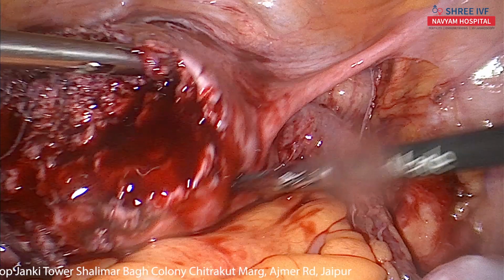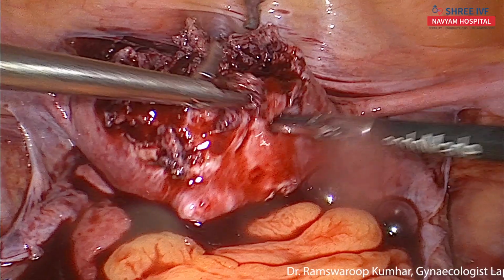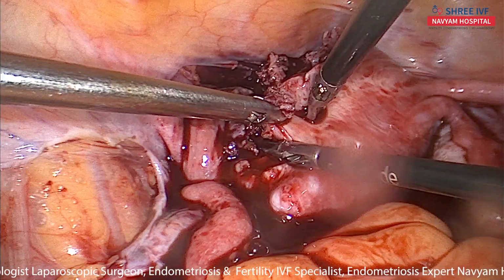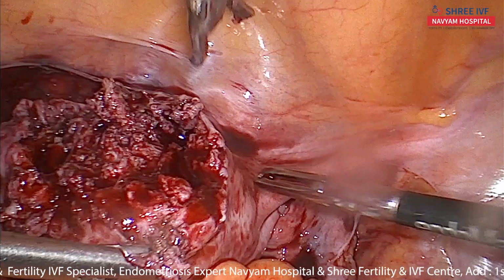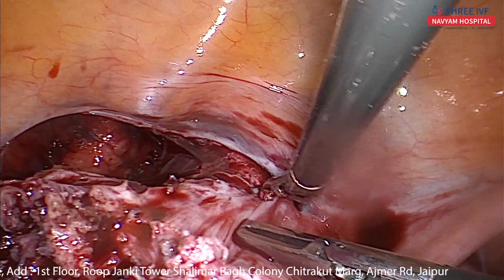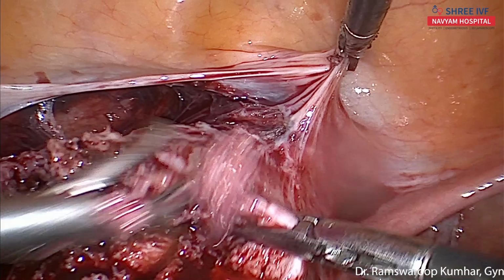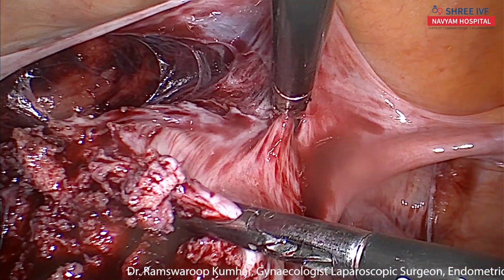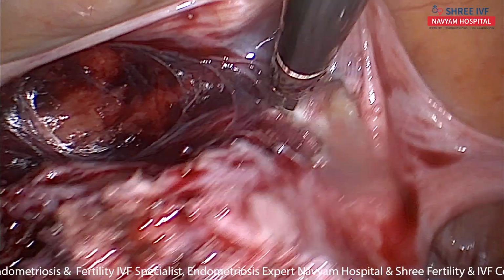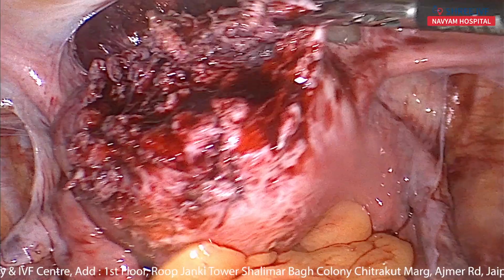Okay. Now we will suture it first, then we will go down. For the posterior wall myomas, this is another myoma. No, not this. These are the separate myomas between. So hold it. Bladder dissection is needed for proper and efficient suturing. Hold this tissue. Bladder is fine, very low down, and we can suture it very well.